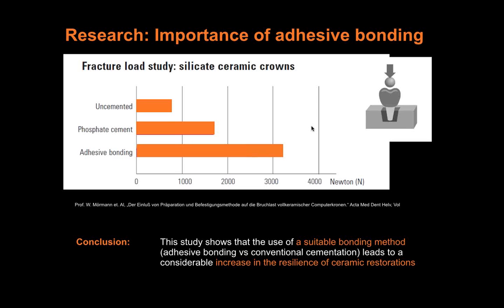Strength-wise, basically, people recommend to adhesively bond it. So they say, what shall we use? I would basically say do whatever you're doing with E.max, because they are very similar materials, and so whatever success rate you had with E.max, do the same thing with Suprinity.